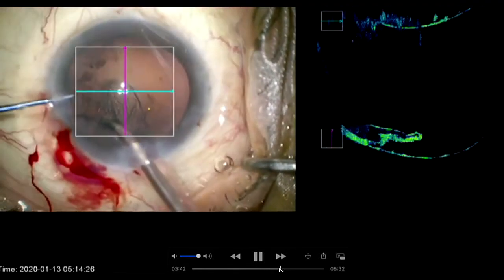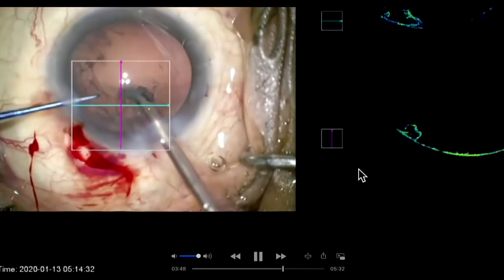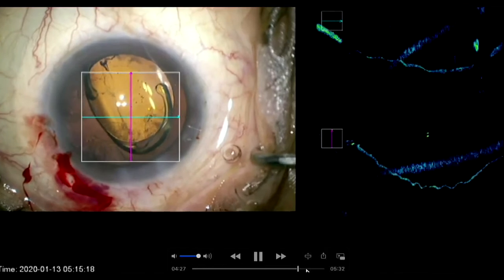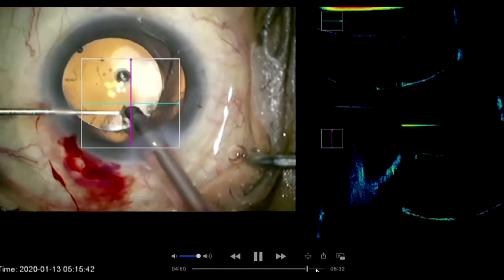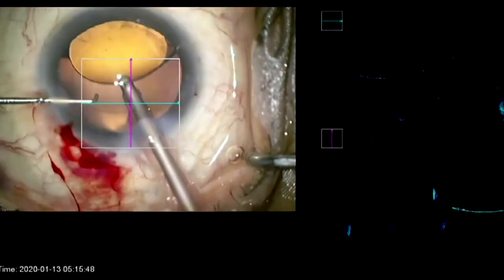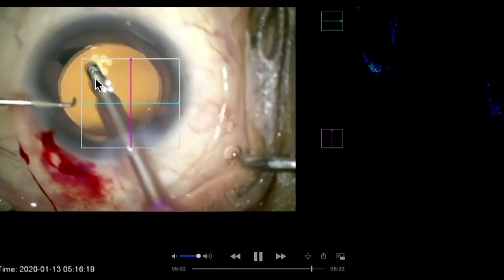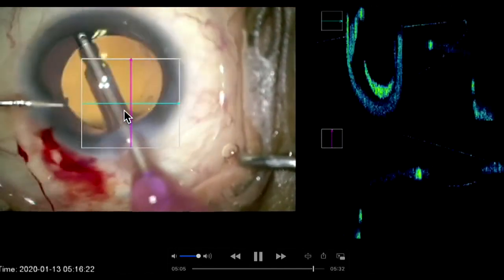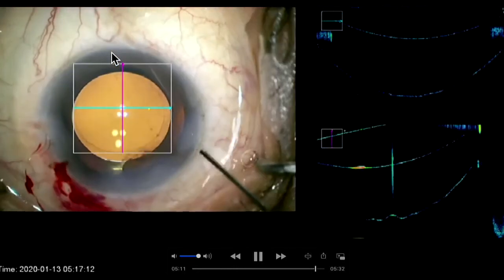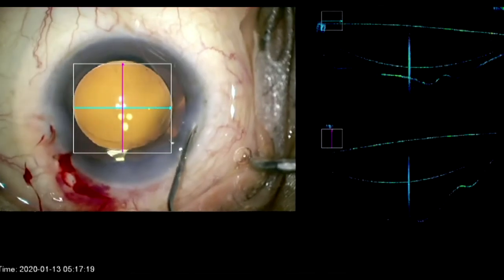Because I had done a very good hydrodissection, I could aspirate the cortex with the phaco handpiece itself. You can see a clear and safe posterior capsule with just a little peripheral cortex remaining, which can be taken subsequently. Then inject the IOL, remove viscoelastic from both anterior and posterior chambers, and do a little capsular polishing towards the edge of the capsulorrhexis — because that will cover onto the IOL surface and should be removed. If you are using a lens with a 360-degree edge, you can place it in any direction. But if the lens lacks an edge at the optic-haptic junction, the best position is 0 to 180 degrees, as that will reduce subsequent dysphotopsia symptoms for the patient.